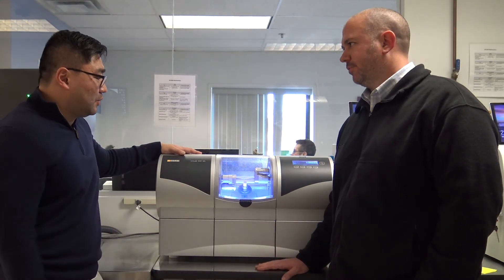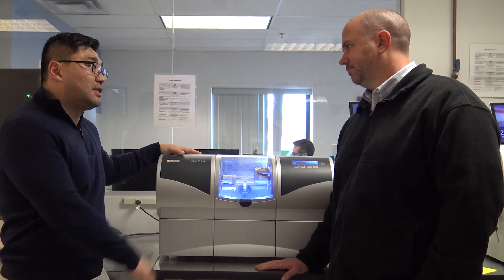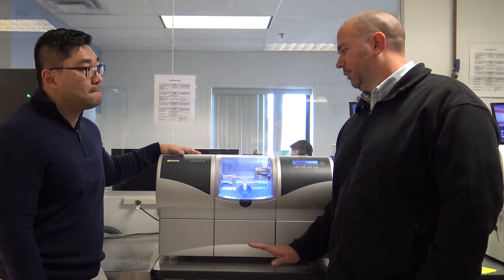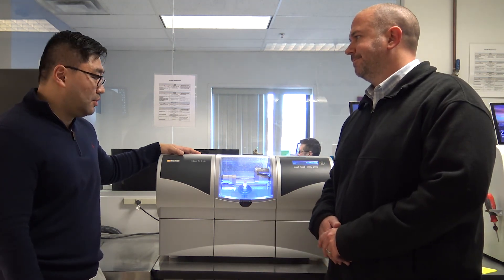So Jay, one question that I had was: are there any restrictions when it comes to materials that can be milled in this mill? No, that's why I really like this mill and the MCX5 — there are no restrictions. You can mill anybody's blocks that you want. Wonderful. So thank you for joining us on our overview of the MCXL. Now moving on to our MCX5 overview.